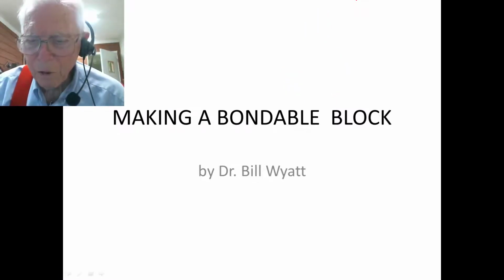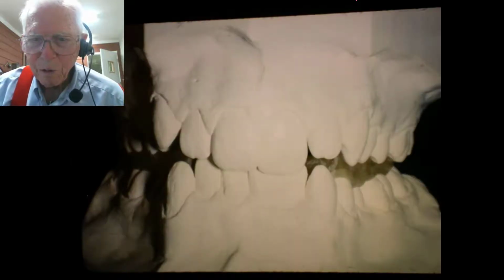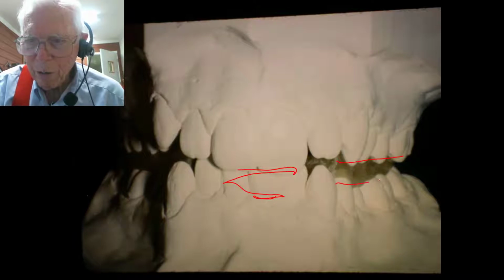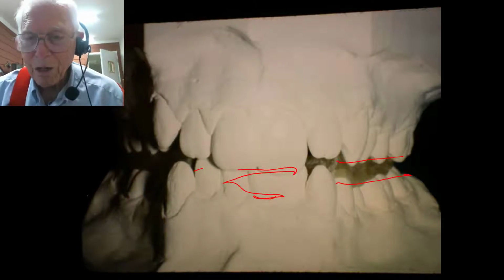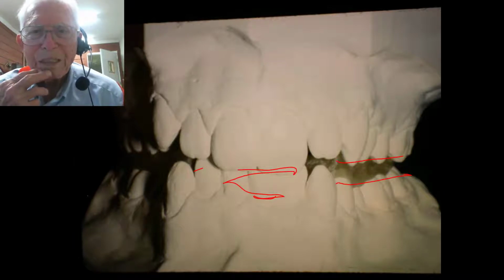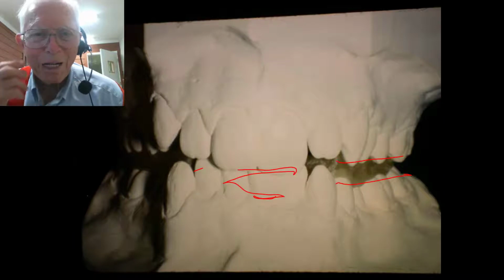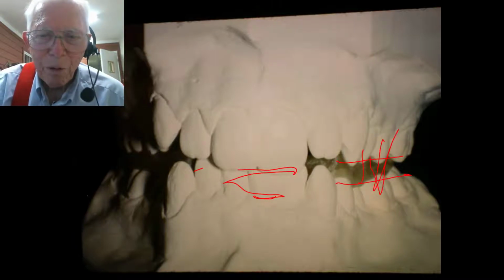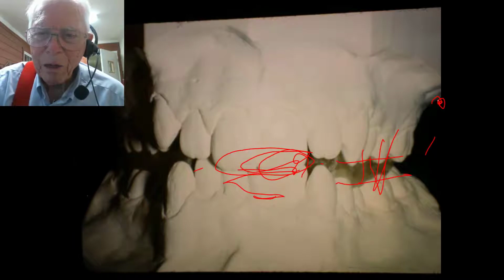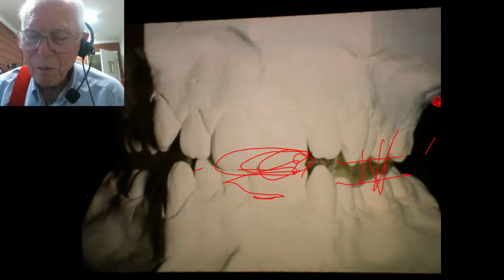But let me get in here and show you how to make the things. Now here's a case with a deep bite, you see, and it comes way down over here. And so we've bonded these blocks like this on the back side, on both sides of the mouth. Now, it's possible, if you had somebody with a lot of pain in their jaw, and you brought their jaw to the front some, and had them bite down on some wax like that, or actually the acrylic, and stop, their jaw could stay there, and there'd be a lot of pressure in this part. But if you put it right up at the front, the pressure's here, and then back on the jaw joint, back in the back of the mouth, back here. And that's when the jaw doesn't like that. And some people, it just gives them all kind of trouble, so you know what's wrong with them.